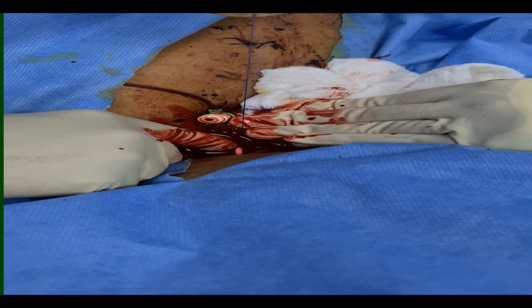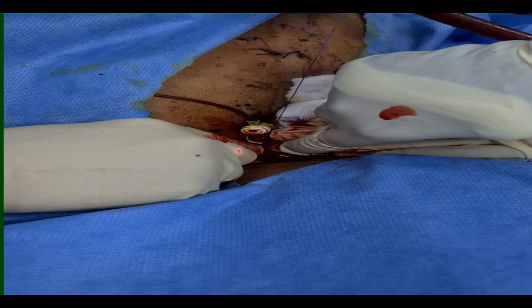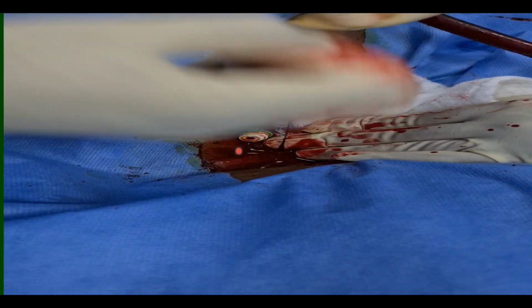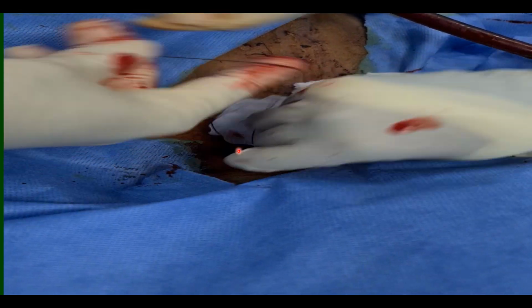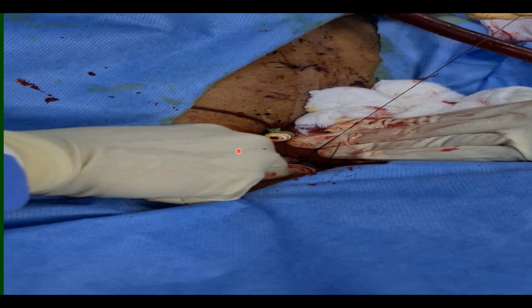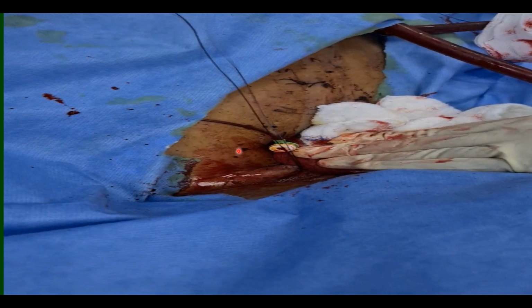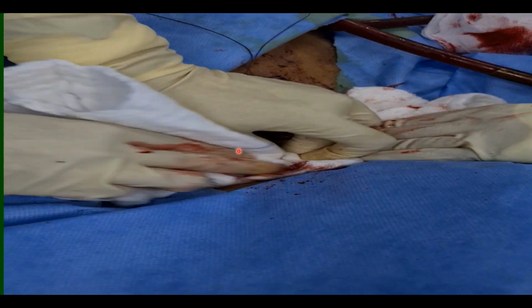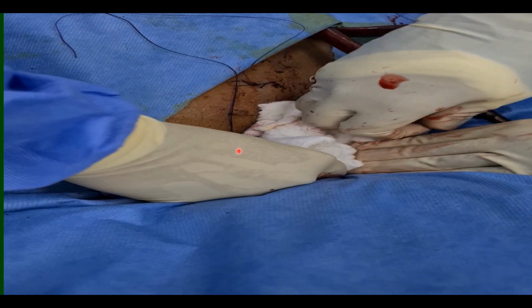This blood is a good sign to ensure that there is no clot or thrombus occluding the artery. They will tie it firmly, and they will compress for about 45 minutes to be sure that there is no bleeding or re-bleeding from the cannula removal site. These are percutaneously inserted and percutaneously removed cannulas.